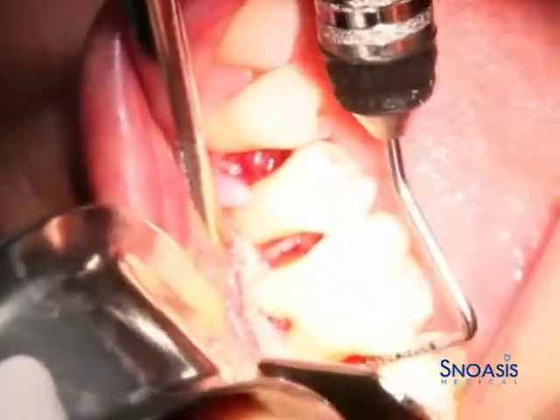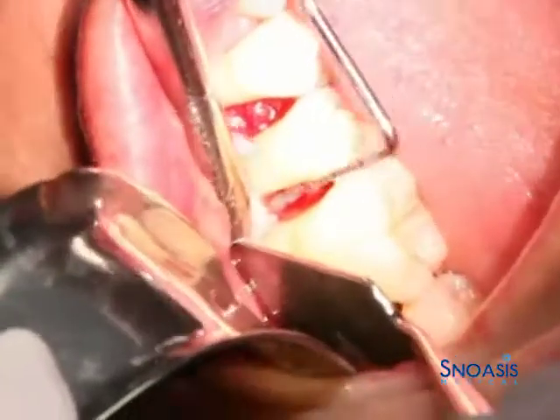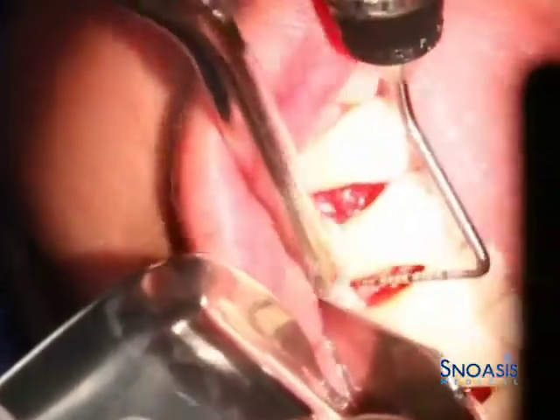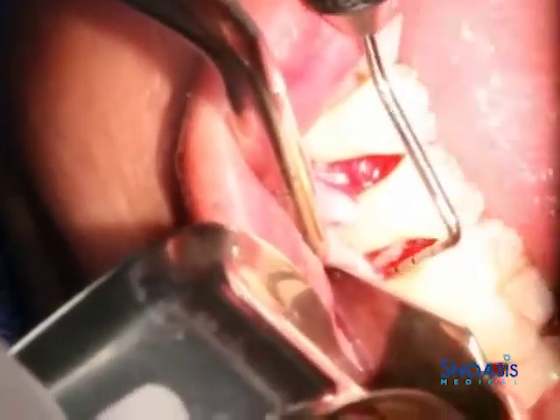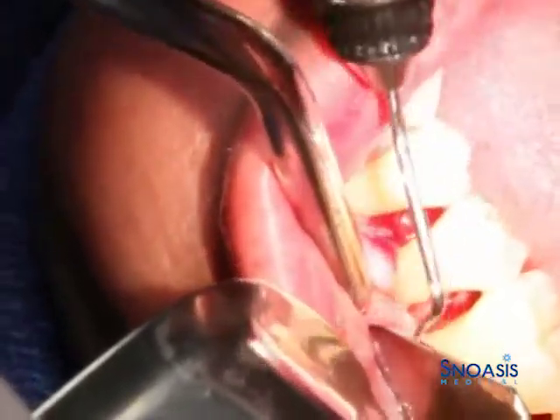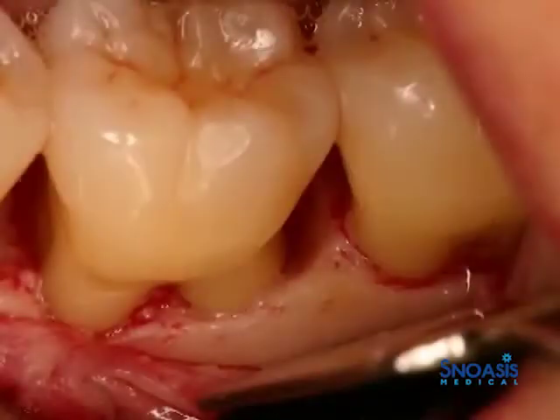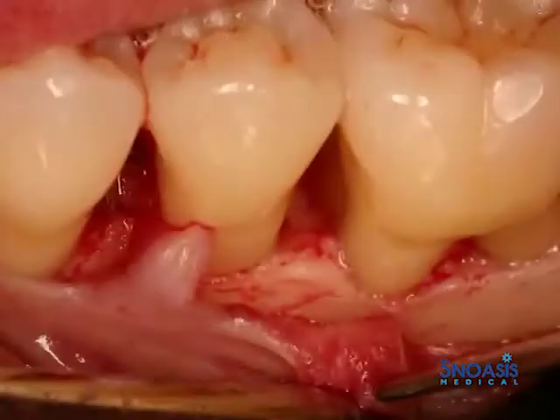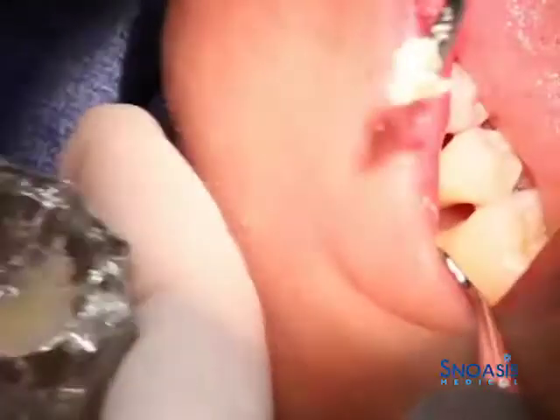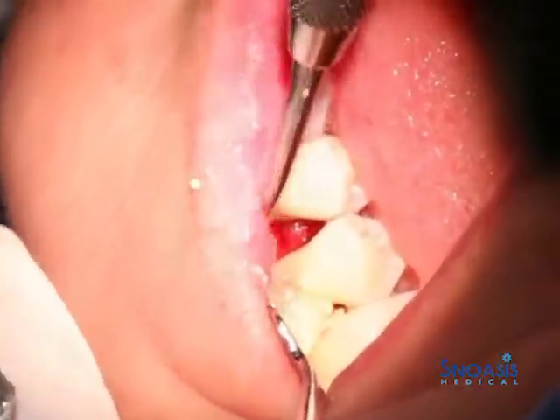We've got about a 5 millimeter defect on the distal. Just a little bit of tissue right there. Close to the same on the mesial. Okay, so we just place a little bit of bone in there.